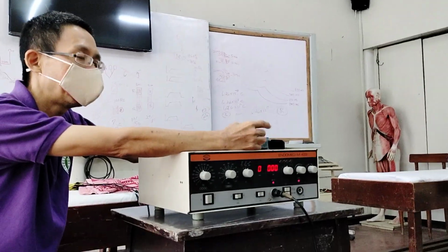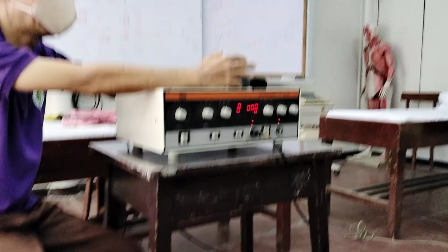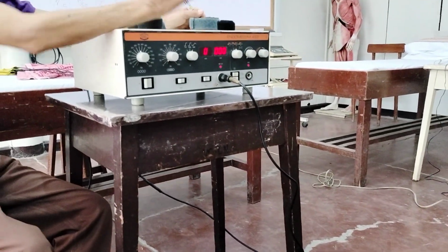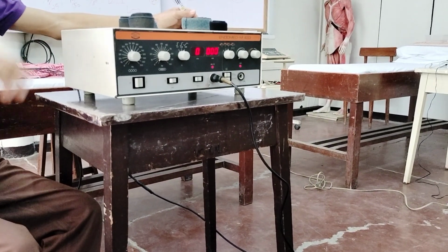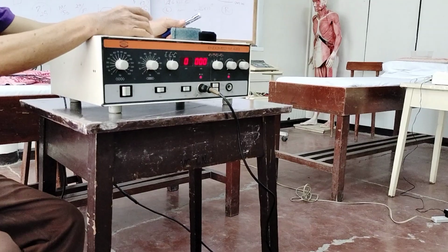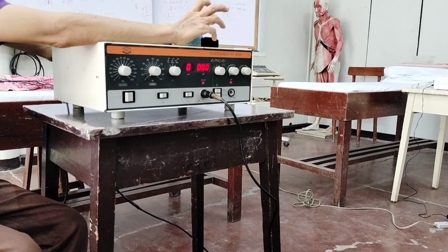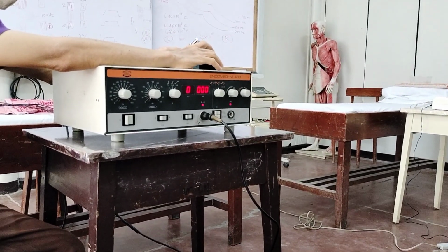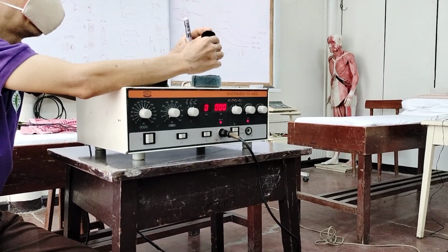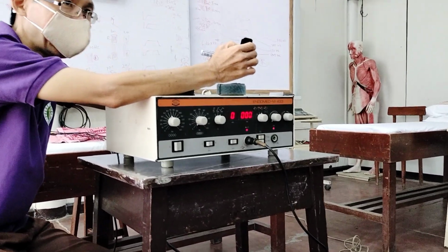Once you start the current, the patient may complain that it is stronger on one side, while the other side feels okay. So you ask the patient which side. As the patient points, for example, to this area, the electrode there is red.